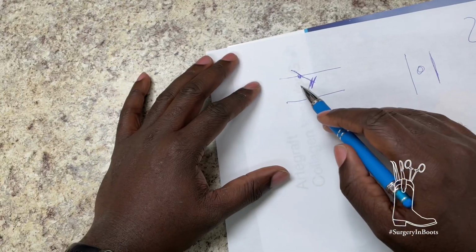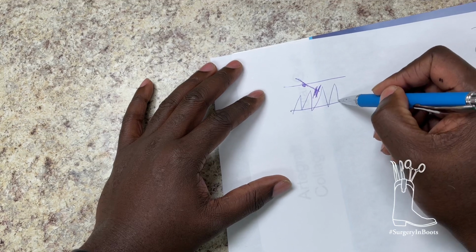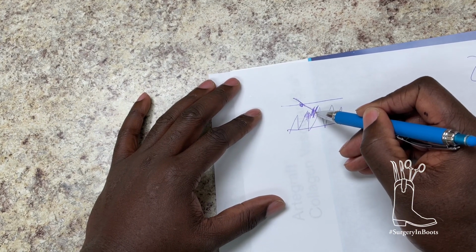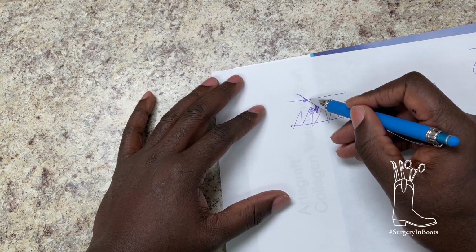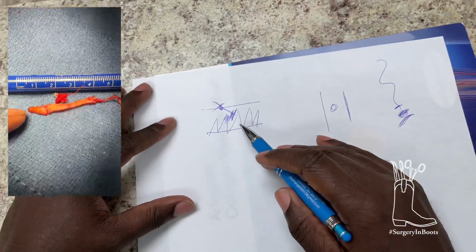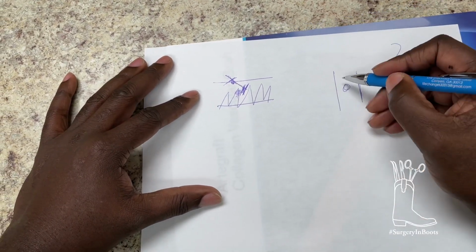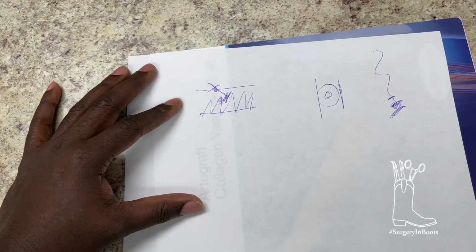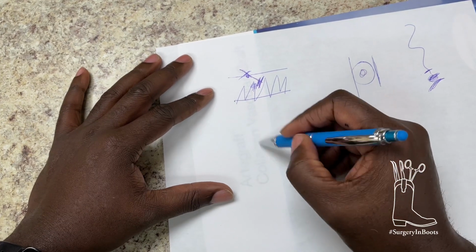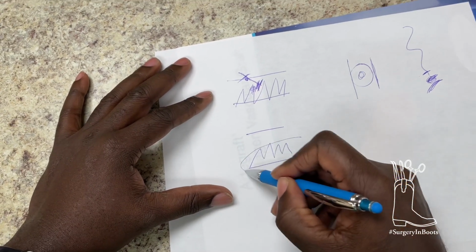So the problem with her was, they did a procedure, but when they went to do the hole closure, there was debris. You can imagine if a piece of debris is big enough, when you pull, you feel like you're pulling up on the vessel, but it's stuck on that plaque. Then when you put this here to clip it like we did, you end up with closure of that artery. So then we go in, make this hole bigger, and pull that out. Now the blood flow is going by, but you still have an artery that on the side looks like this. Then we go in and take that out.